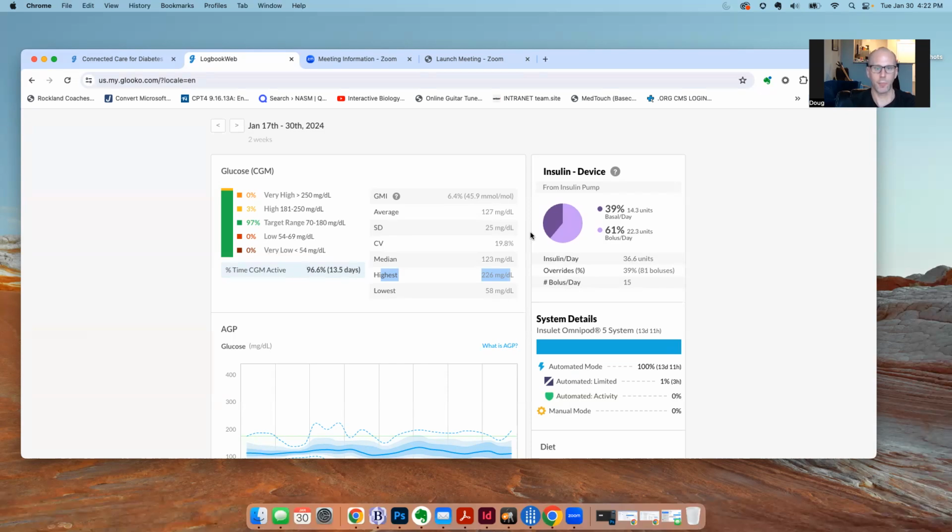So it's trending up pretty aggressively by the time the course starts. And in a perfect world, I'm in like the 160 range while I'm working out. It stays there, and then when I finish the course, it ends. What happens sometimes is the F45 class may not be as intense as the one on the previous day. So if there's less of a cardio component and it's a slower pace workout, if I take a ton of sugar, I'm likely not going to burn as much off, and therefore I'll go pretty high and it'll come down a little bit slower. And that's where some of these higher numbers are.